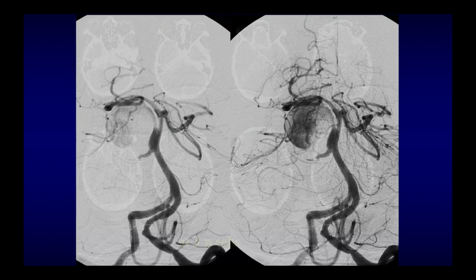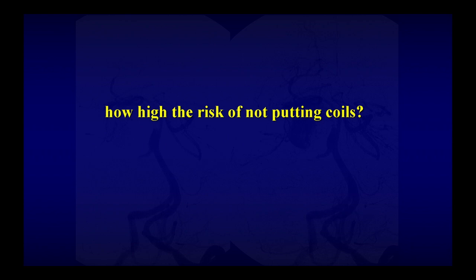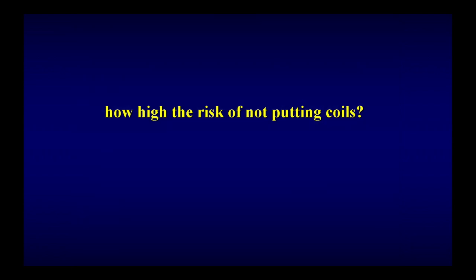And the only solution we can propose now is, and this is the angiogram that was made at the time, to put coils. And we have seen that by putting coils, we have decreased a lot the rate of hemorrhages due to ruptures of aneurysms after flow diverters. So some people don't like the coils. I agree. I would rather not place the coils, but there is a risk. And I'm not sure I want to risk a hemorrhage and then tell myself how stupid you were, you should have put the coils.